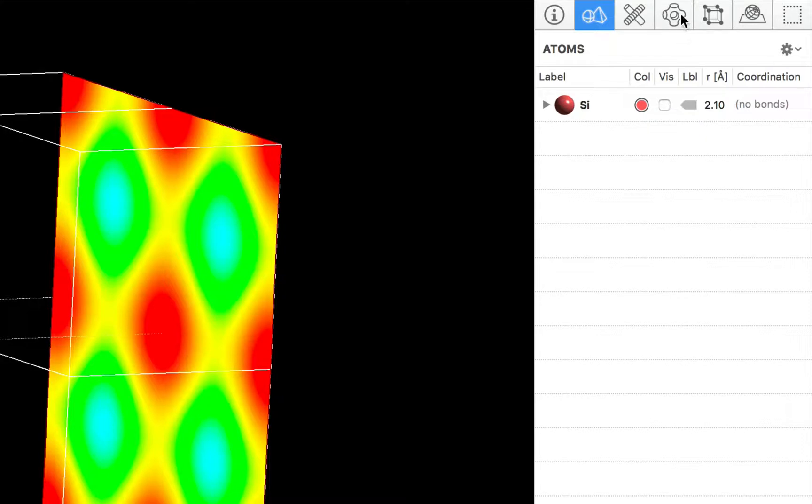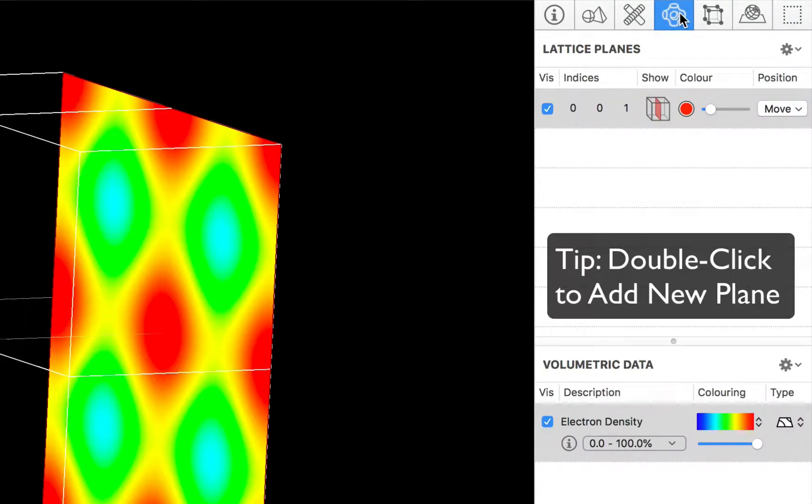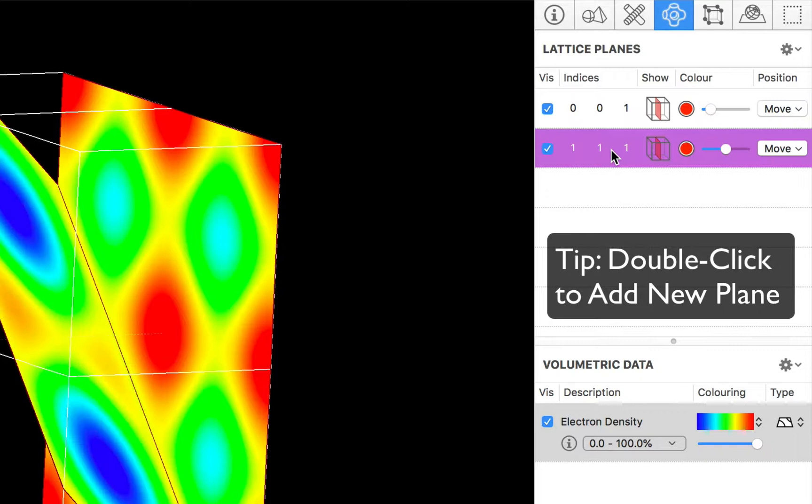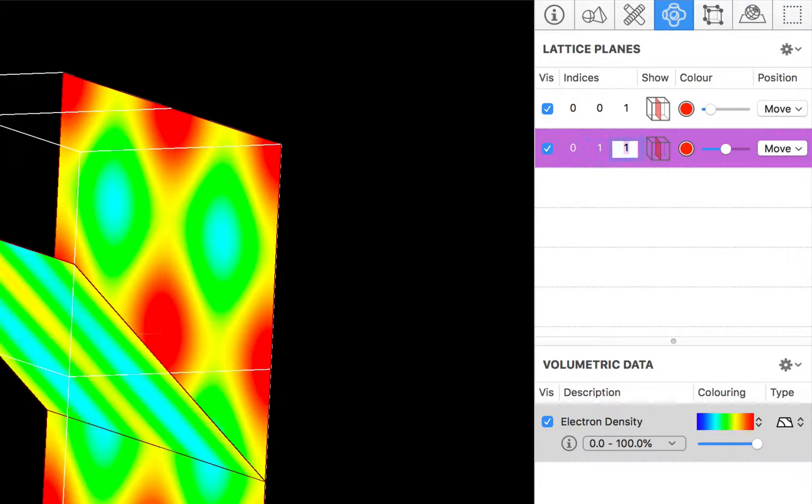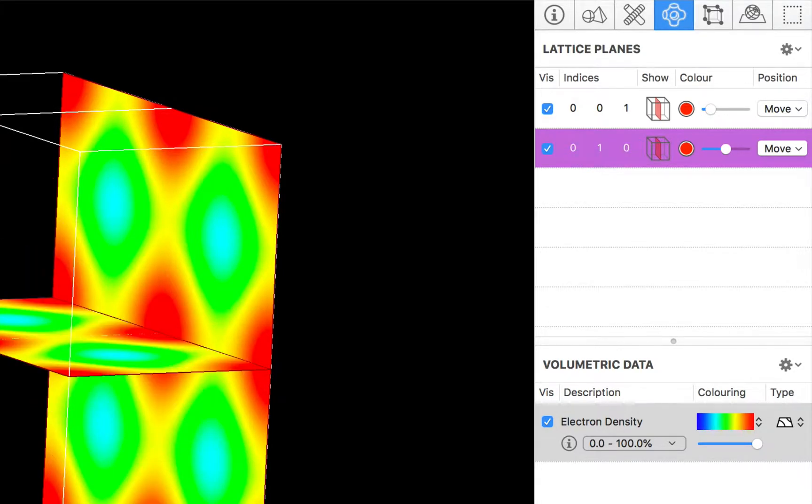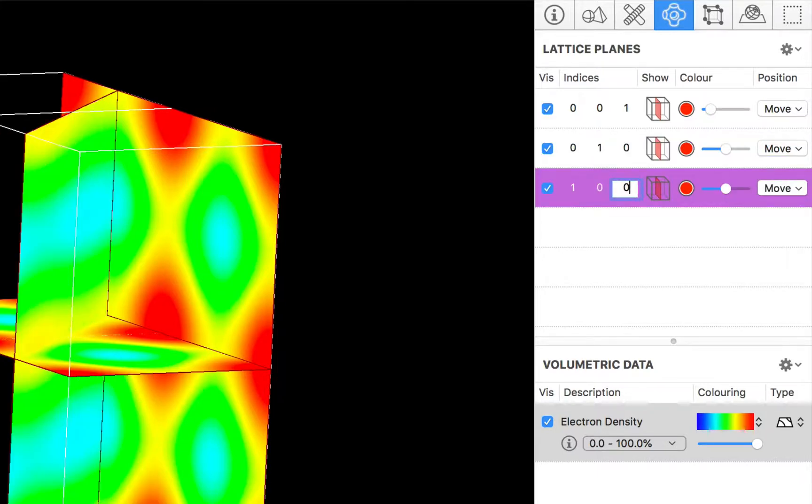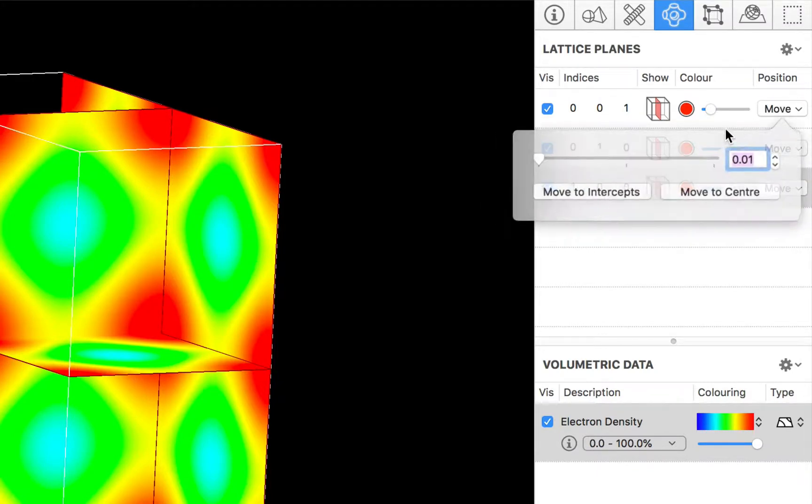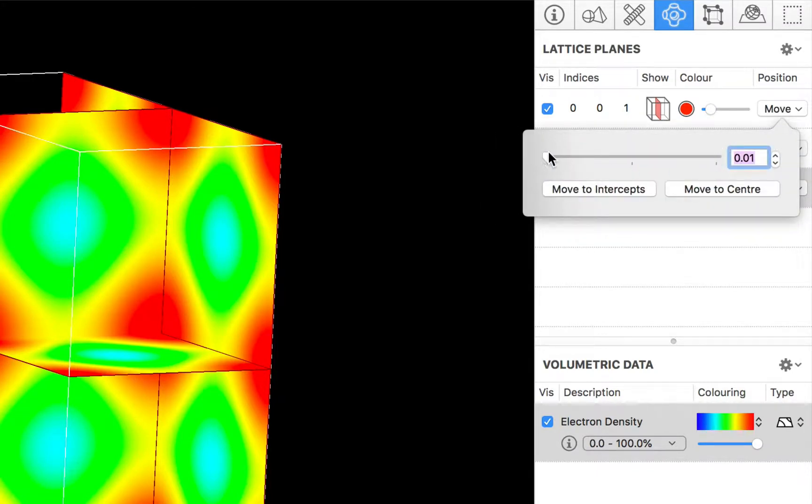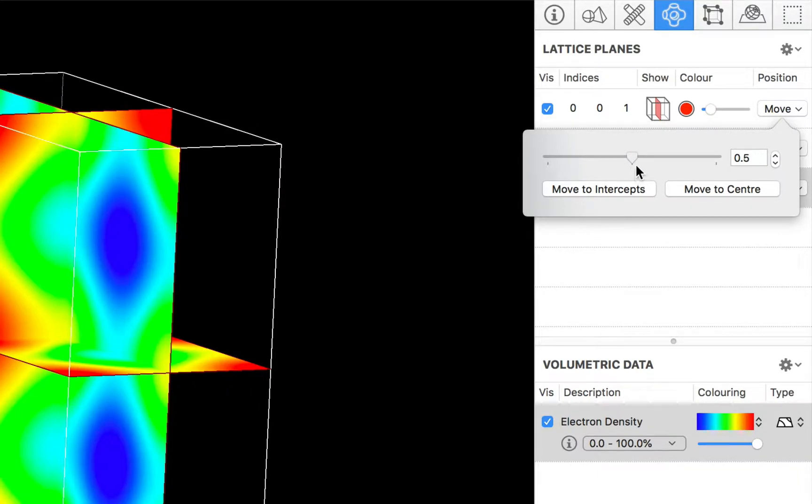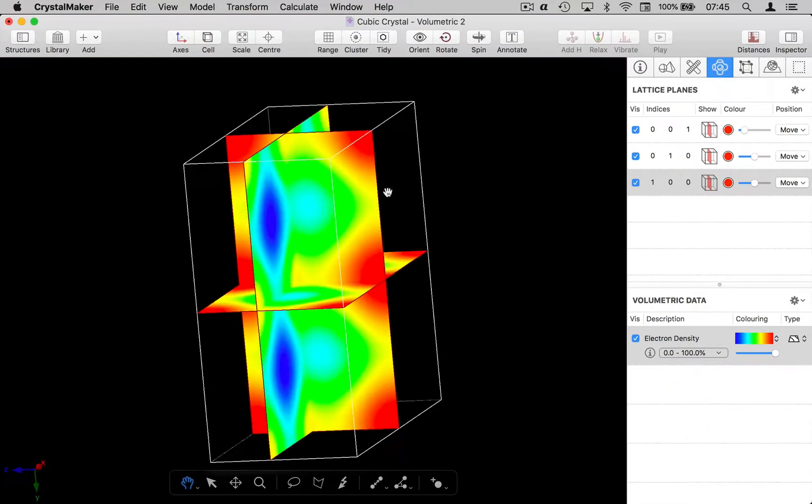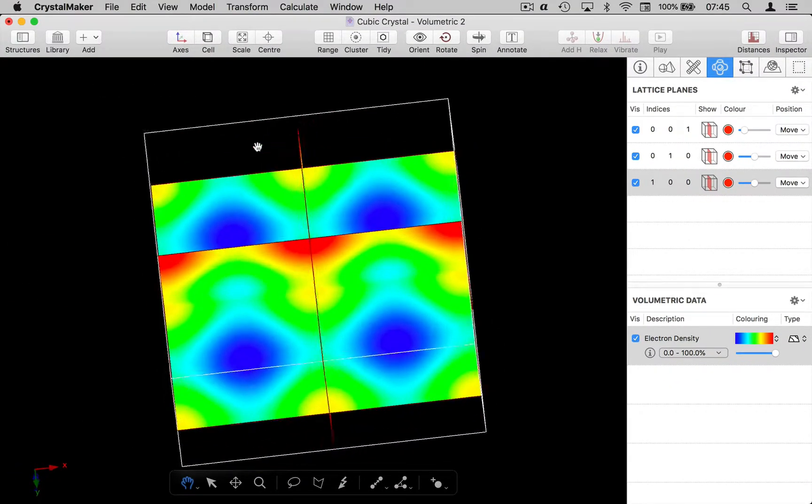Let's go back to the volume inspector and let's add a few more lattice planes. So I'm going to add an 010 plane and we'll have a 100 plane. Let's move the 001 plane back into the center of our plot and as we rotate we get a nice display.